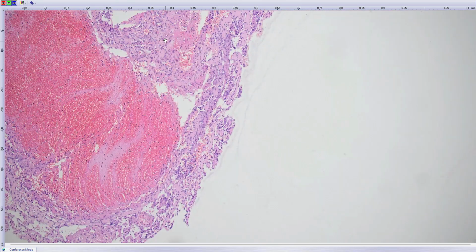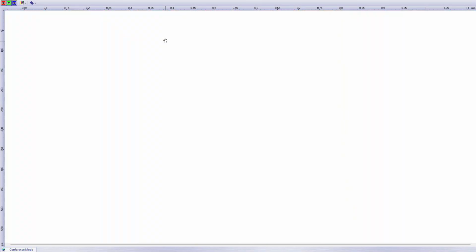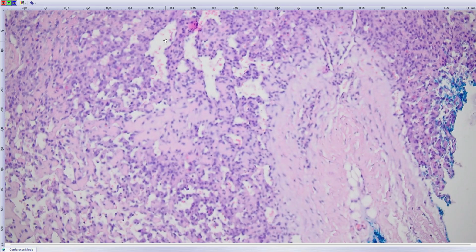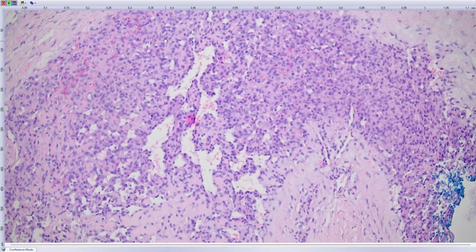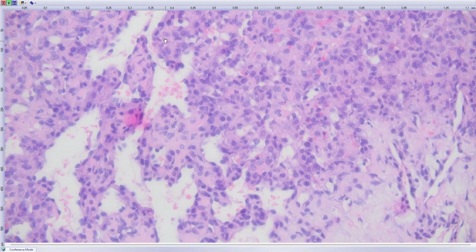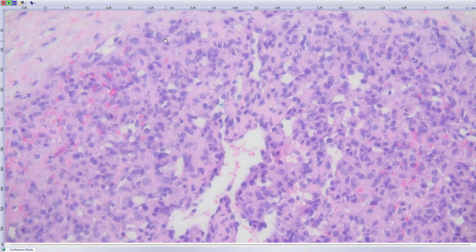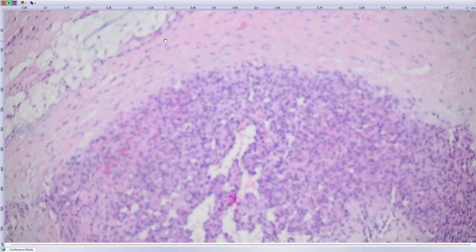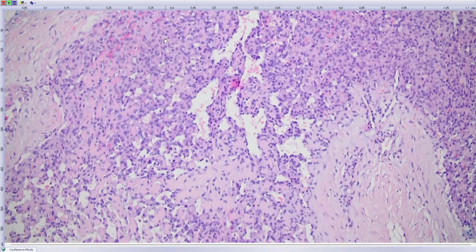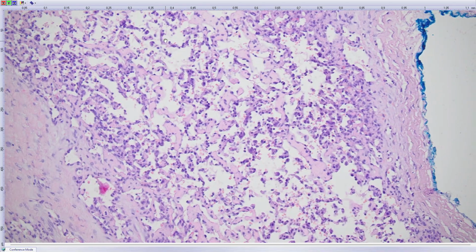And right next to it, basically transitioning from the forming thrombus, you have this vascular lesion. And if you go to highest power, cytologically it's a little bit hyperchromatic, but no major atypia, no mitotic activity either. Any suggestions what this could be, or what would be the differential here? Anybody? Not only the residents?